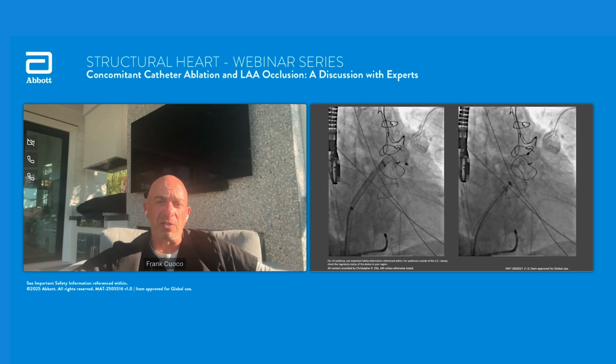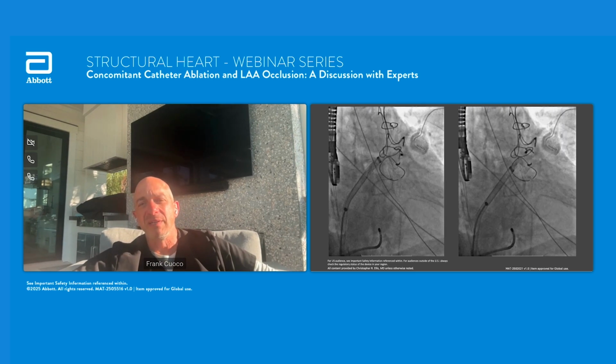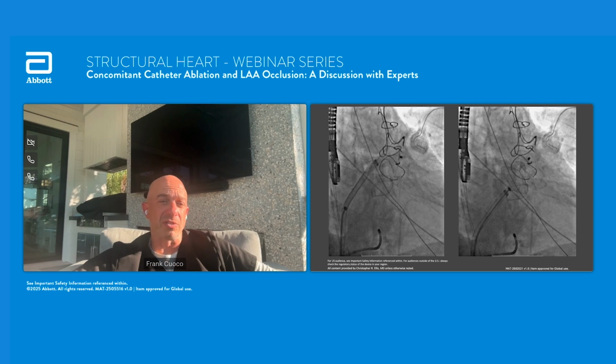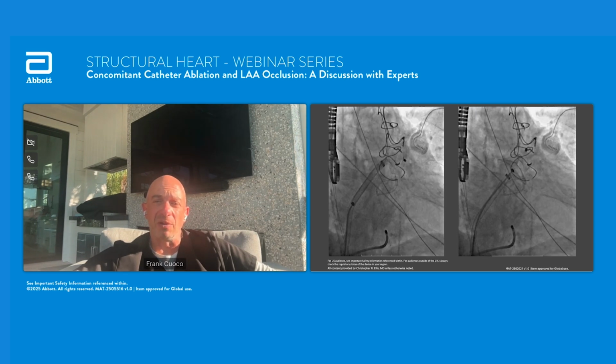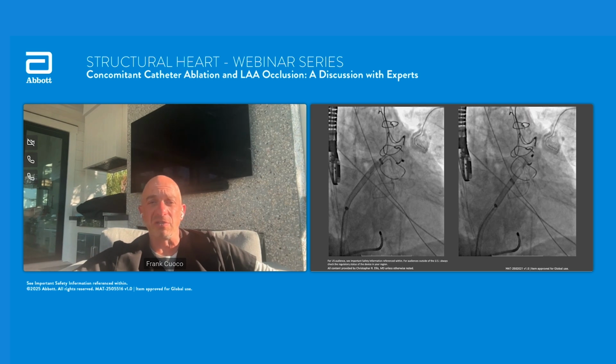And I agree. Localizing where you're going to be and trying to figure that out. Most of the time we get away with a mid, slightly anterior stick with these concomitant procedures. But I agree, there are some gnarly appendages where you really need to be as low as possible. And that can make your ablation more challenging depending on what sheath you use.